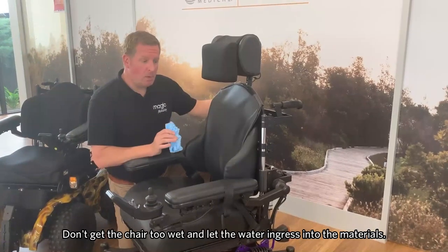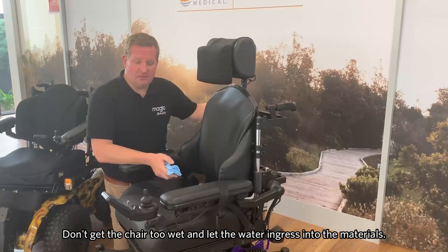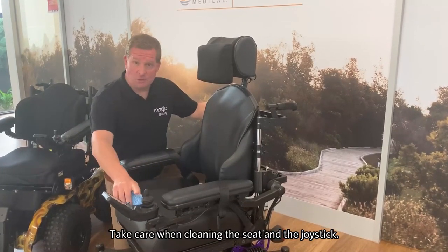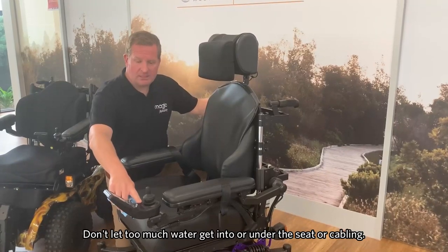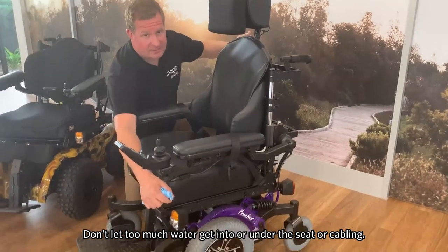It's important to remember when cleaning the chair not to get it too wet and let water ingress into the materials. Take care when cleaning the seat and the joystick, and also avoid letting too much water get into or under the seat and onto any of the cabling.